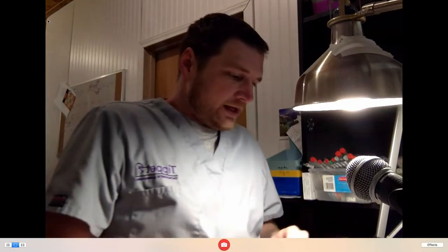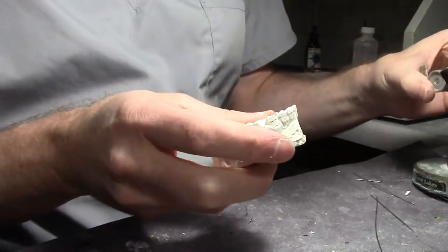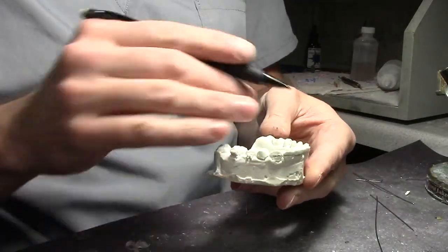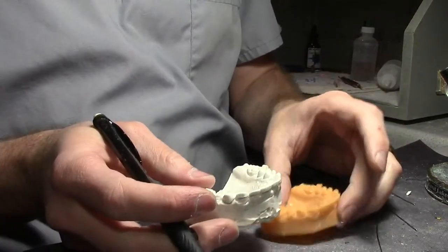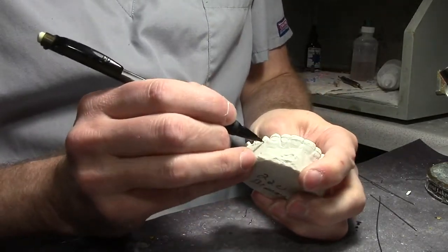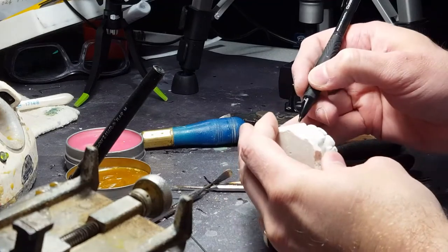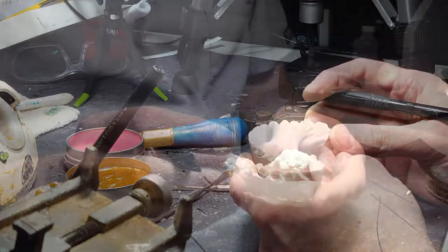We may be having internet problems. Here's the model that we're going to be using today. I've already designed it and prepped it. It was a 3D model that I duplicated, and I just did a simple impression with an impression tray and then poured it up in stone, just so that it's easier for me to work with.